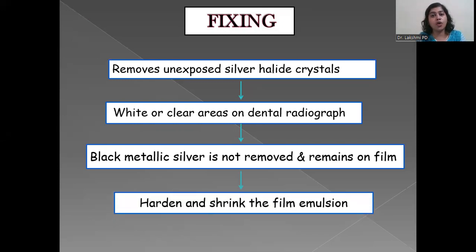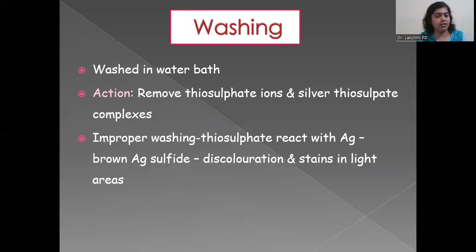However, on prolonged exposure to fixing solution, that is, if a film is dipped into a fixing solution for a prolonged time, these black metallic silver grains will also slowly start getting dissolved into the solution. And the last function of your fixing solution is to harden and shrink the film emulsion.